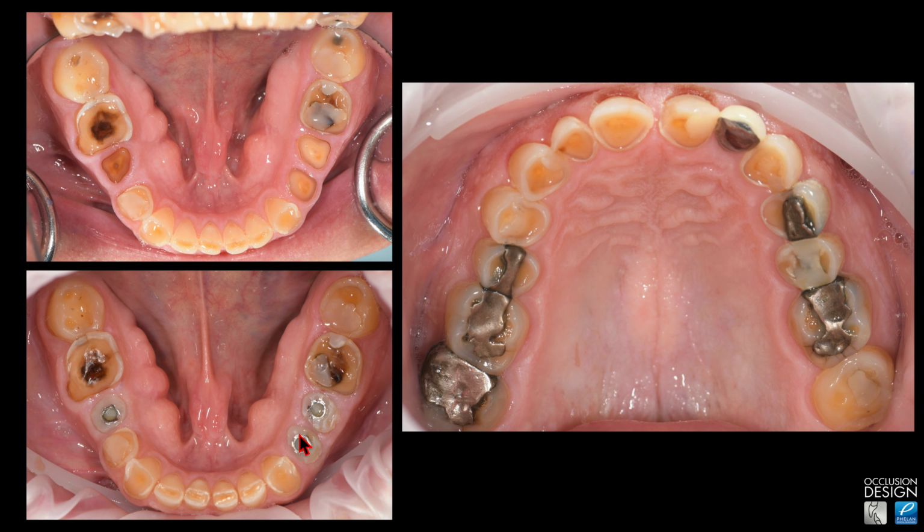And the advantage of that, especially with an immediate implant, is you're maintaining the soft tissue and the hard tissue outline form, as opposed to using a stock healing abutment that doesn't really go out in that oval shape that a bicuspid has, especially when you cut it off at the root level. So, I think that this was a really good service for the patient. I did this as the initial phase, plus some gingivectomy and some changes, and then let that heal. And then we went to the full preparation days.